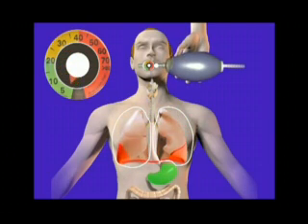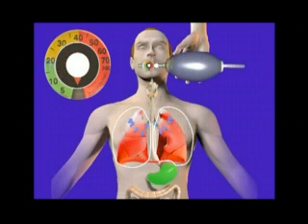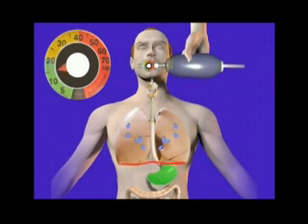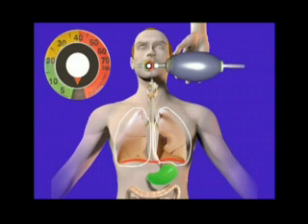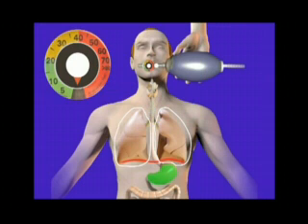Harmful hyperventilation occurs when too much volume is delivered in too short a time frame. Hyperventilation causes alkalosis, high intrathoracic pressures, a decrease in CO2, and many other complications. Maintaining lower inspiratory pressures with the use of a manometer naturally limits the number of delivered breaths per minute, resulting in increased inspiratory times and reduced chances of inadvertent hyperventilation.